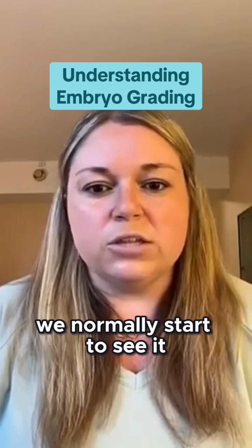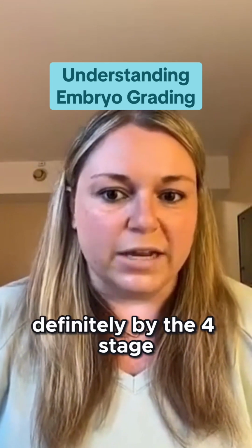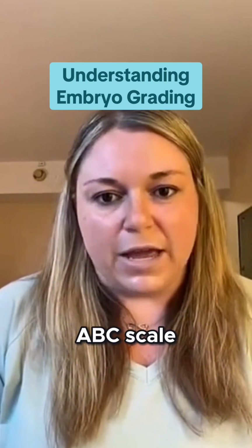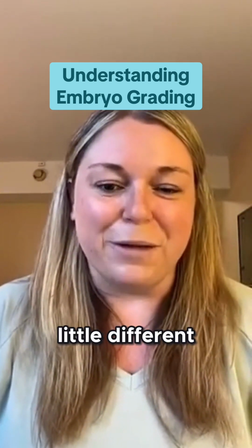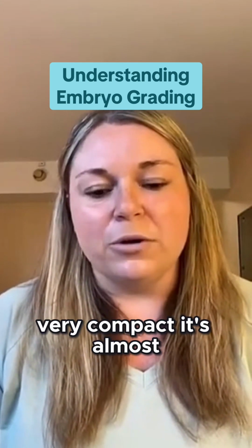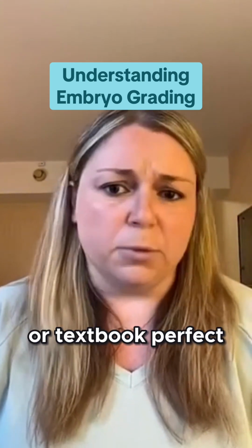We normally start to see it maybe around the 3 stage, definitely by the 4 stage though is when we hope to see it. And we normally grade it on an ABC scale. Some clinics also do a D as well, but every clinic's a little different. But if it has an A grade, that means that it's very compact. It's almost round in appearance, and that's what we would say is above average or textbook perfect.